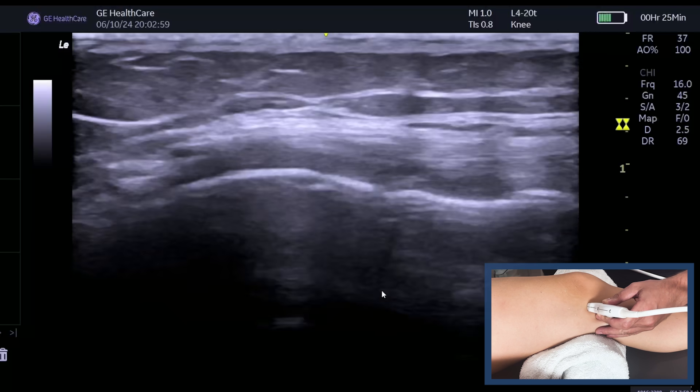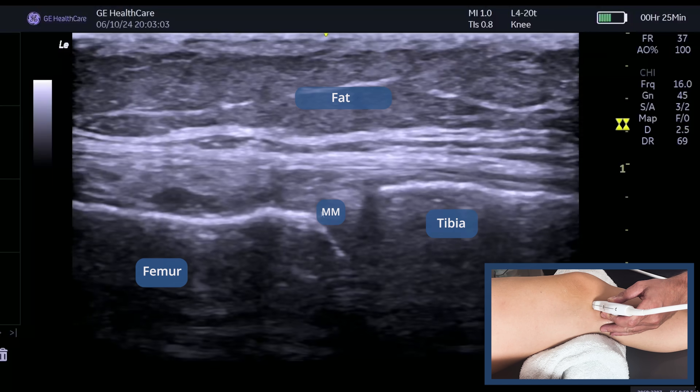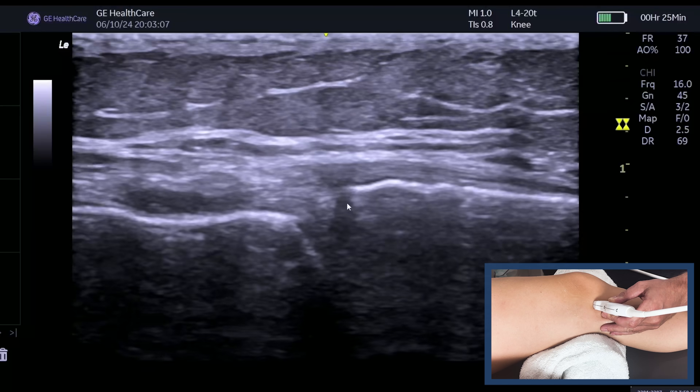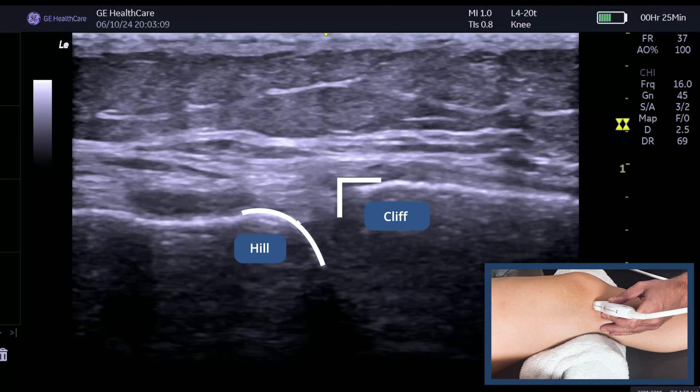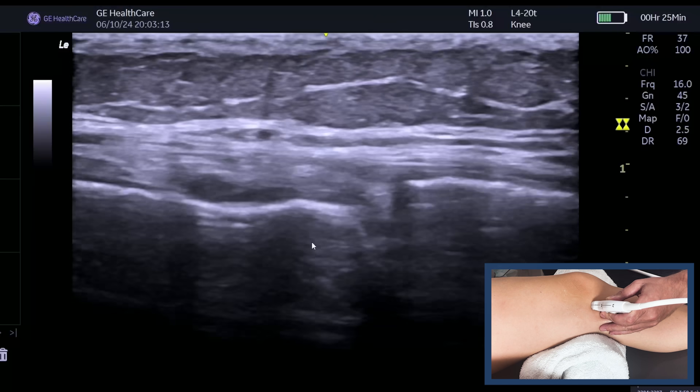As we slide down, we can see the medial knee joint space here. This is the tibia — we know it's the tibia because it's more like a cliff. Over here is the femur, which is more like a hill.